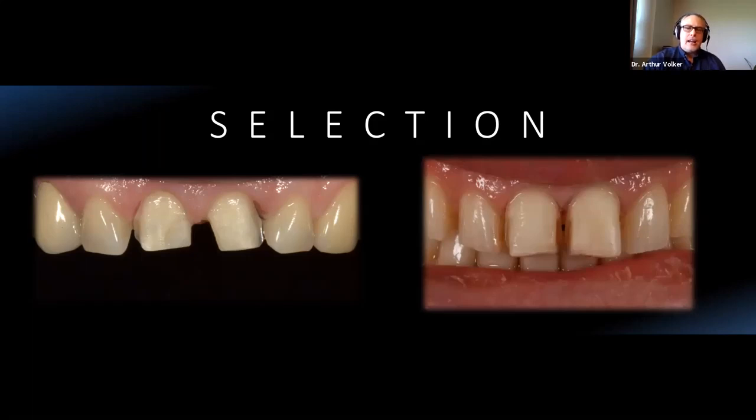Now take a look here at this interproximal area, or in other words, take a look at this negative space that we see between the centrals. And a lot of times, especially early on, a lot of doctors would prescribe or say, hey, I really want a translucent material because, you know, my stump, my underneath color looks quite good. So I want it enhanced, but you don't. Because what you're looking at here is you're looking at a very dark negative space.